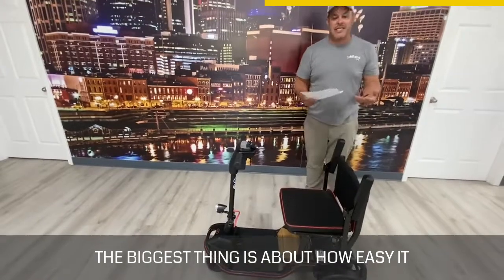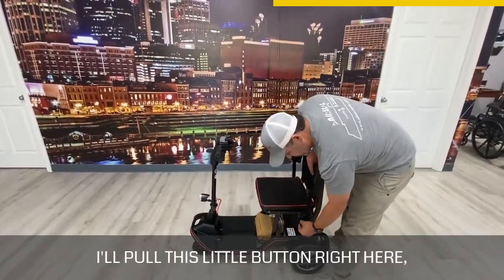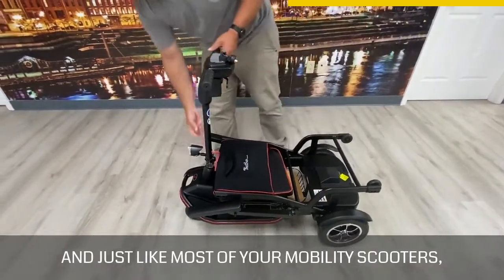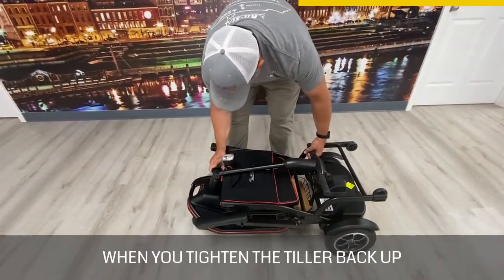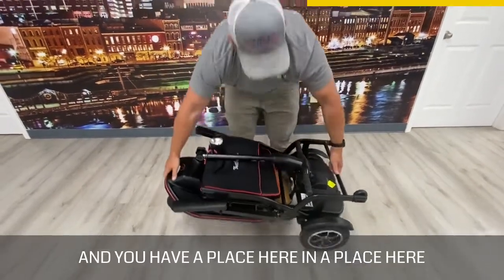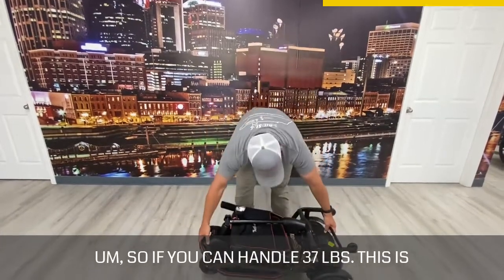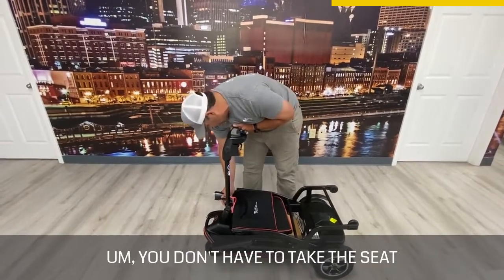The biggest thing is how easy it folds. When I go to fold it, I pull this little button right here, just pull that out and push down — that folds it. Like most mobility scooters, you'll notice the tiller gets loose, and you tighten the tiller back up. You have a place here and a place here, and you have 37 pounds. It's really not that bad and it's easy to carry. If you can handle 37 pounds, this is a great device — you don't have to take the seat off or anything like that.